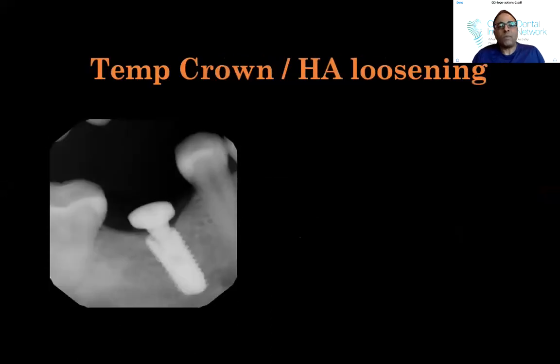So now we have our temporary crown or our healing abutment that loosens, right? Patient calls you, I got something in my hand. And I've already had two patients call me during this COVID mess. One has a temporary crown in their hand and another one has a healing abutment in her hand. So oftentimes this will happen.